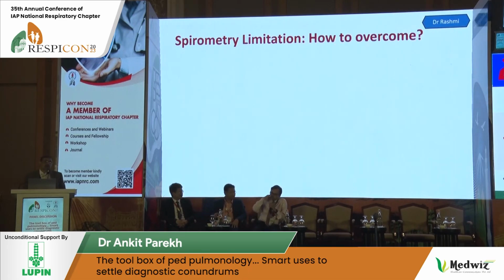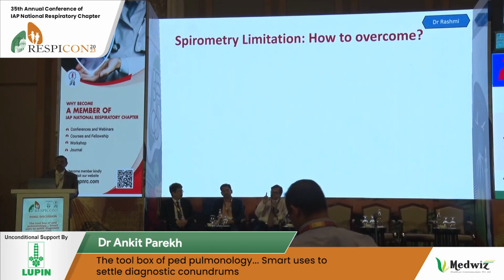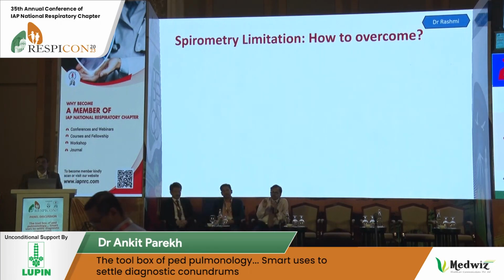Another thing I should tell is that in most of the children, because they do not exhale for the next 3 seconds or so, we get a restrictive pattern. So this restrictive pattern should be taken with a pinch of salt. They should be trained, see whether they have adequate flow, and then it should be interpreted. So this is very, very important.